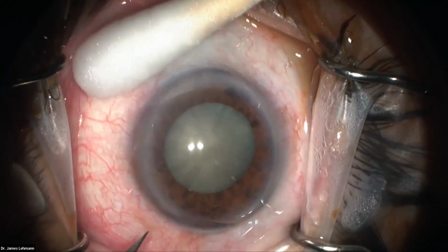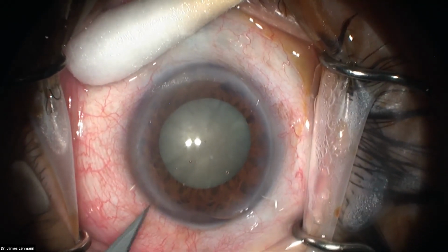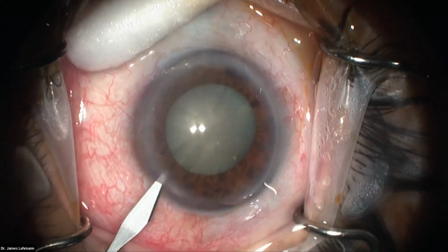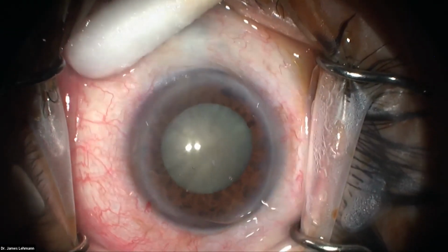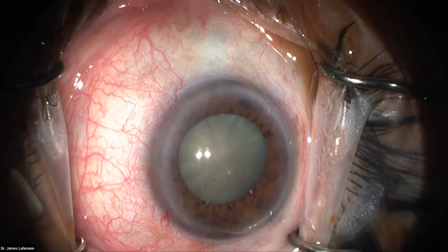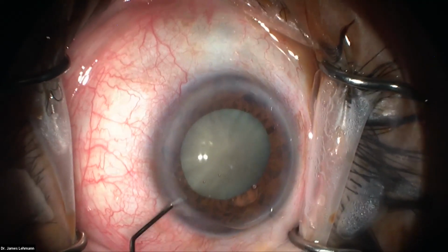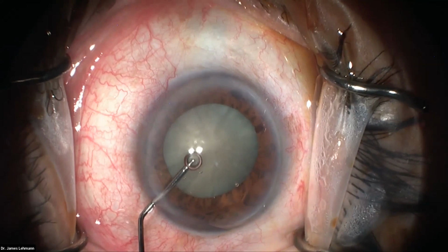So let's make our paracentesis. Some surgeons look for a very prominent vessel to know where their paracentesis is, or another trick is just to go and nick a vessel a little bit so that you get a little bit of bleeding like that and you can know where to go back so you don't lose that. You also want to make that incision in the iris plane, not down. And then this is some lidocaine with epinephrine to help with dilation a little bit. And then we're going to do the vision blue next.